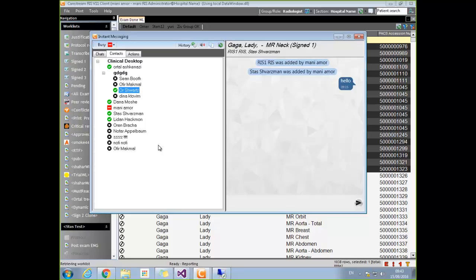Yeah, a lot of us have that kind of Notes experience, and that's what we're used to. But there's a lot of other chat applications out there as well, and that's a problem. Yeah, I did a lot of the design on it, and my perceptions were colored by Notes as well. Is there a way to integrate that to an AD so that you can actually search or add people based on their profile, or who may not be RIS users maybe?